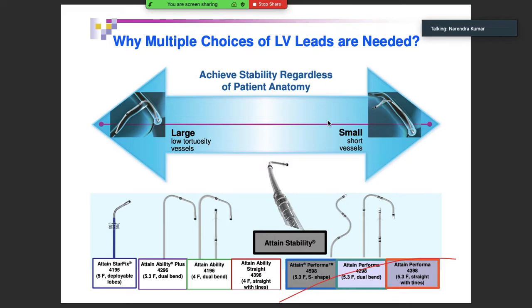And if they are having an AV block as well, you would expect a high percentage of ventricular pacing that cannot be managed with the algorithms of RV pacing. That is where you have to think of such a kind of patient. So indications we are now aware of. Can someone tell what the contraindications are which we had discussed earlier?